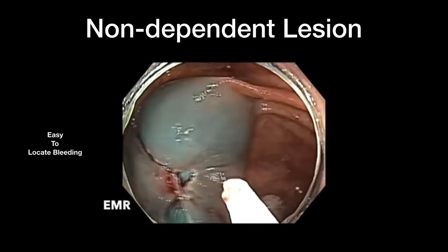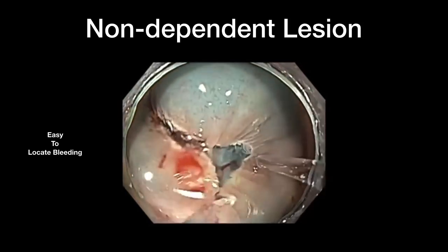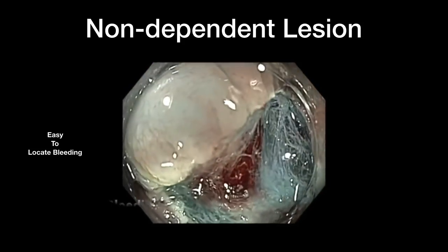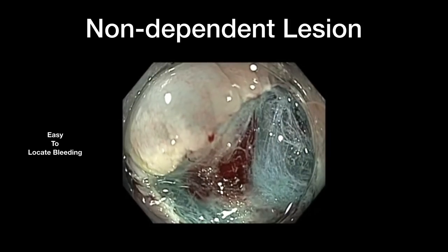We went ahead and did endoscopic mucosal resection in a piecemeal fashion. After resection of the second piece, we noted bleeding — an arterial spurter. This could be controlled with a snare by changing the settings on your electrosurgical generator to soft coagulation, or you could also control this bleeding with a coagulation grasping forceps. While your assistant is making arrangements, you could use the cap to apply tamponade and control bleeding, as shown here.